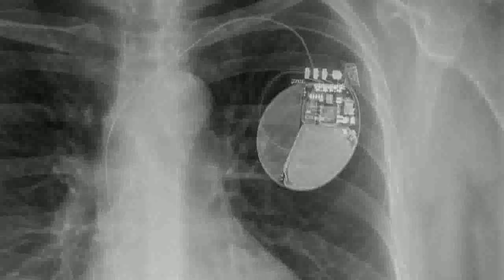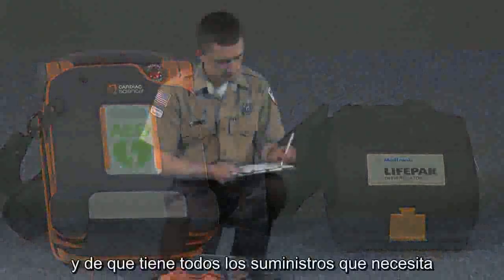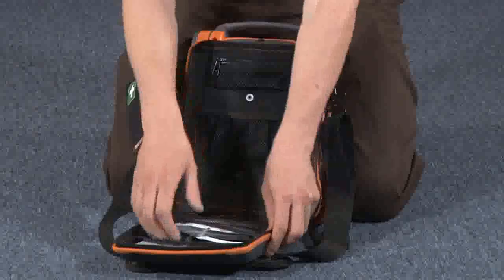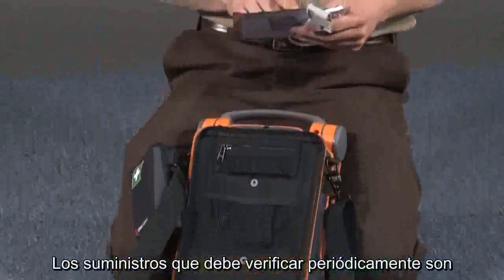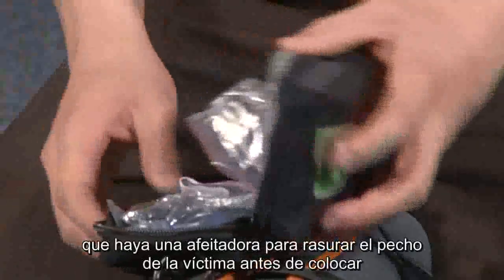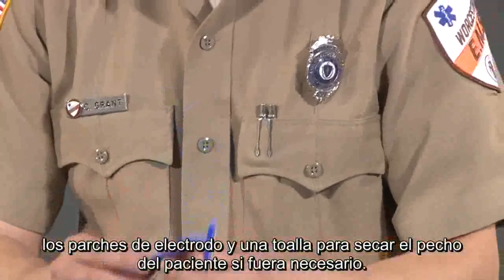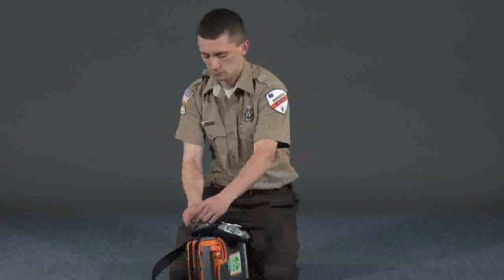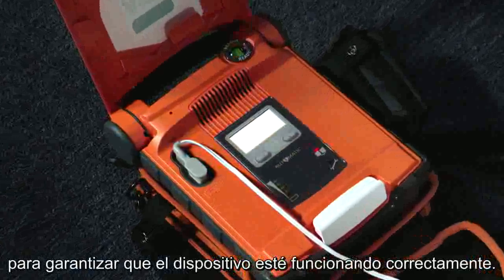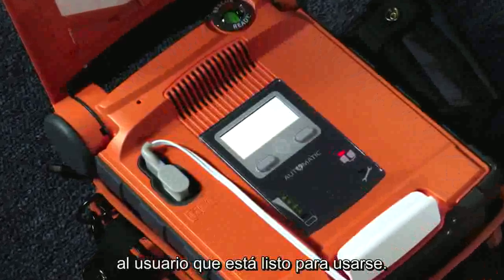implanted device. Inspect your AED periodically to ensure that it will function properly and that you will have the supplies you need whenever you respond to a cardiac emergency. Supplies that you should periodically check include unexpired electrode pads and fully charged battery, a razor for shaving a victim's chest before attaching electrode pads, and a towel to dry the chest if necessary. AEDs run their own internal diagnostics to make sure the device is working properly. Each AED has its own unique way of indicating to the user that it is ready for use.